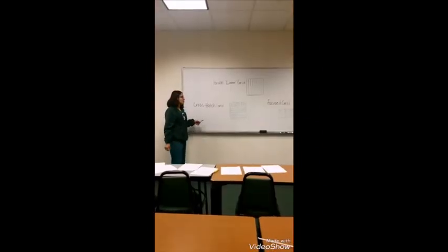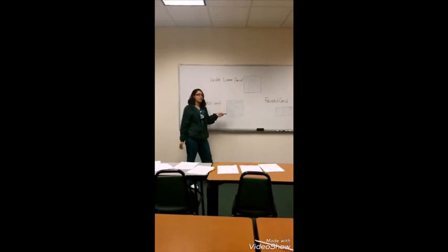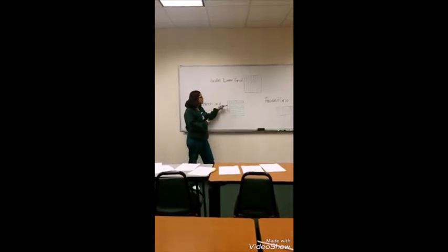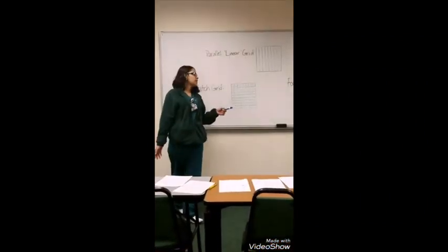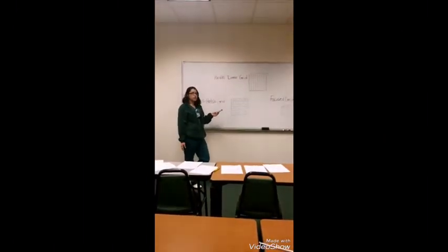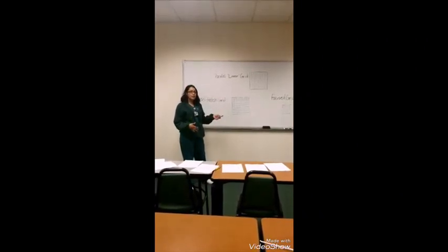The next grid that I will be talking about is the crosshatch grid. This grid is actually two parallel grids that are smushed together and they're perpendicular to each other. There are two different colors so you can tell which is which. This gives you a higher patient dose, and it's the first grid that was invented and used. This grid cannot be used with angulation.